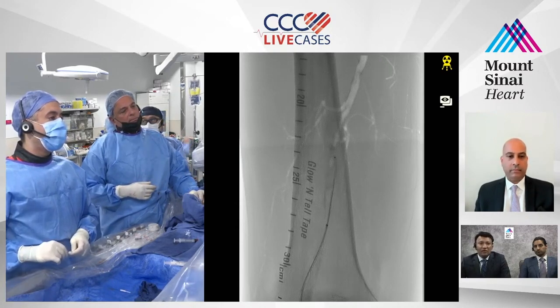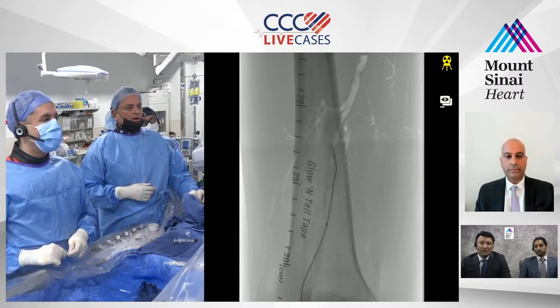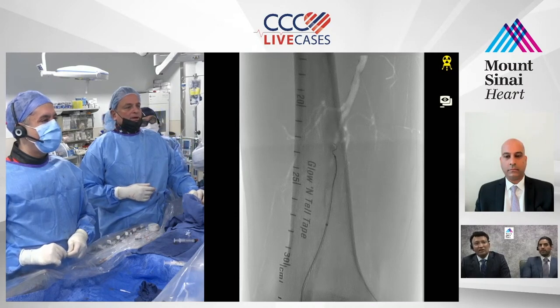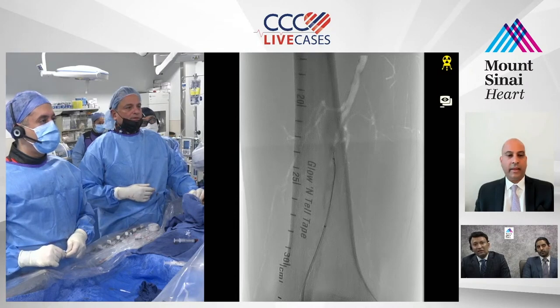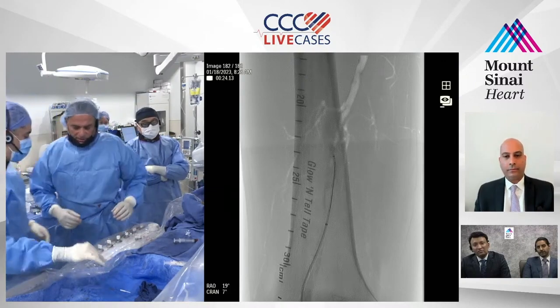I don't think it's a difference. Whether you're from above or below, it's just going to work. No, it's just a bulky device going through a pedal vessel. That's why I'm asking. Get a Terumo wire. Which wire is this right now? He's just trying with a Command. I'm going to try with the Terumo. Get a feel. Yeah, it's in the plane.